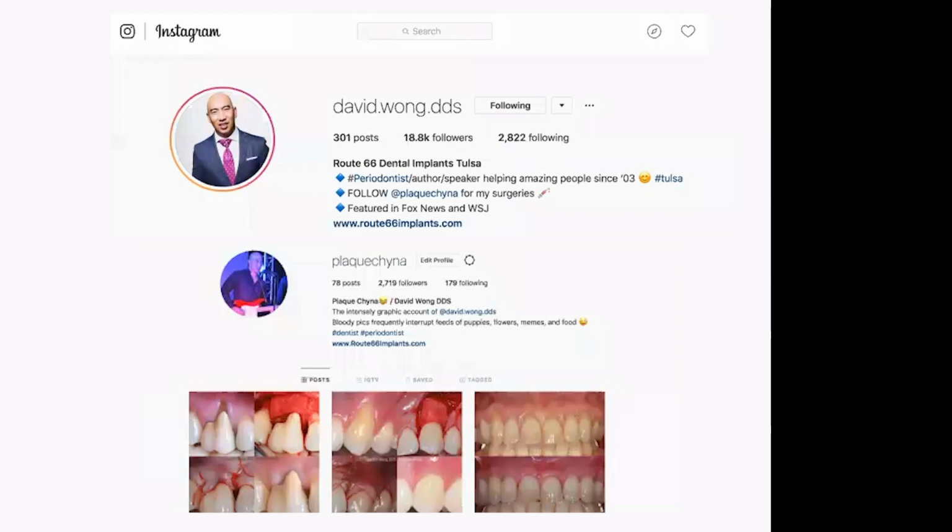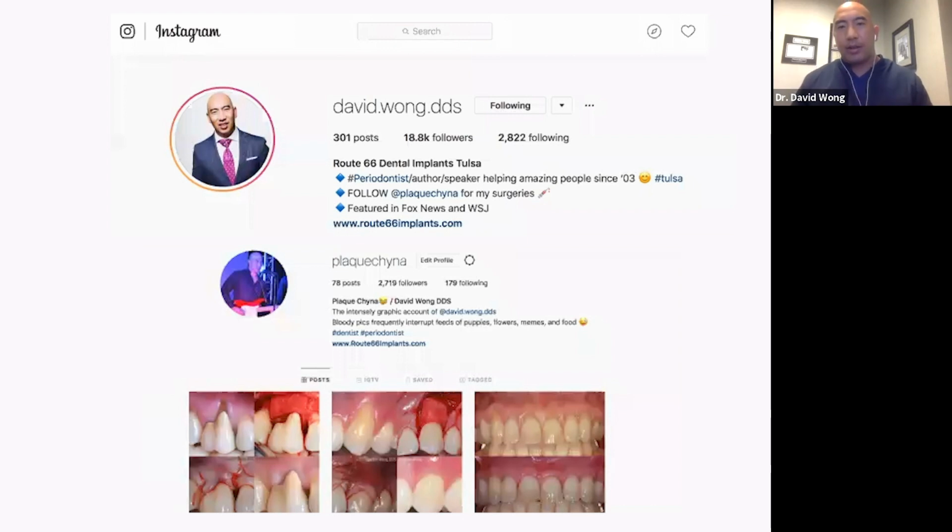Do you always utilize PRF with allograft to graft the gap in immediate placement? I do now. Before 3 years ago, I did not. I used a regular membrane, but now I use PRF because, if you look at the expense, I think it's something in the neighborhood of $4 to $6 per patient, including the disposables and everything. So it's very inexpensive to do.